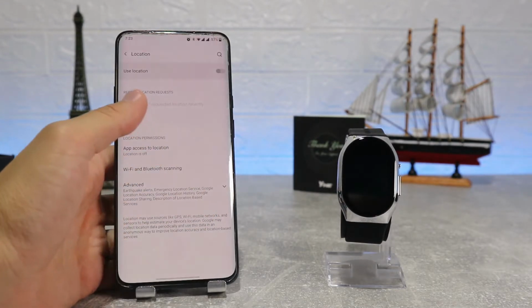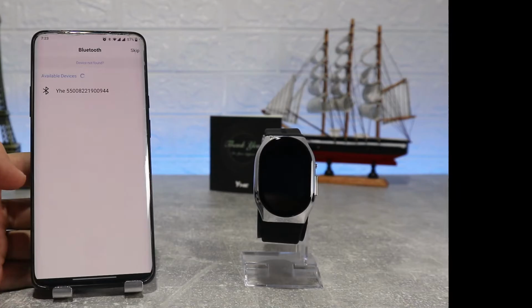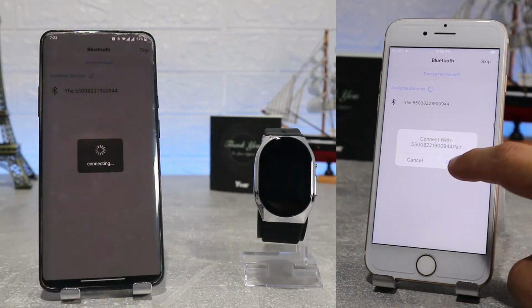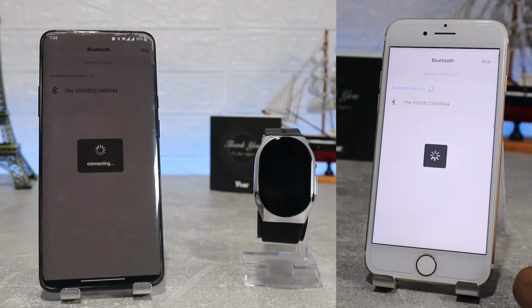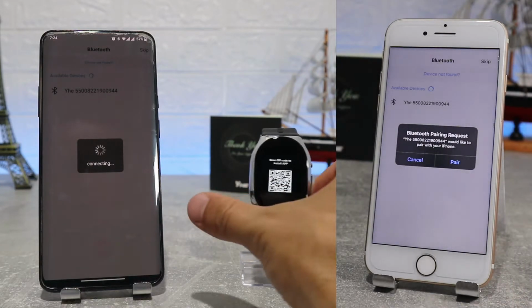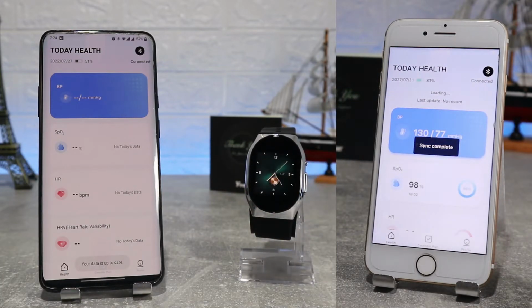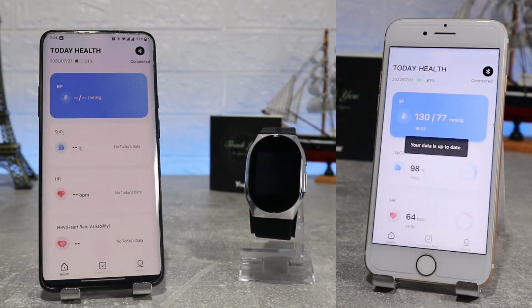Now, we will start to search for our smartwatch. As soon as we see it in the list, we will click on the name of the device to connect our watch. We will confirm and it will start to pair. Now our watch is connected successfully and we can start browsing the features that this app offers.